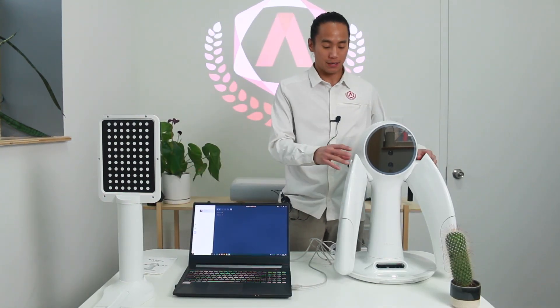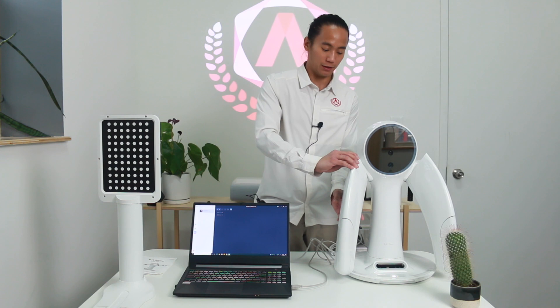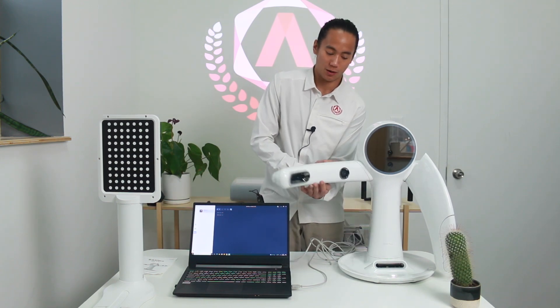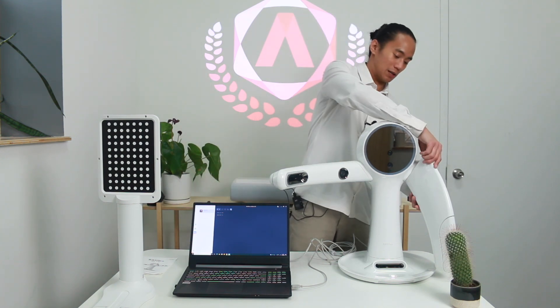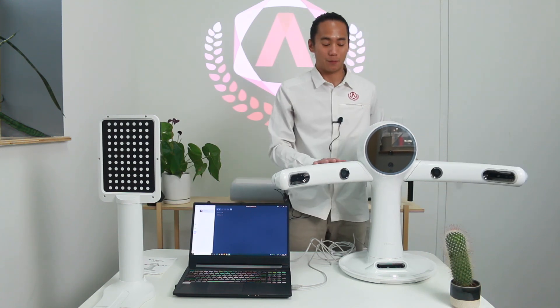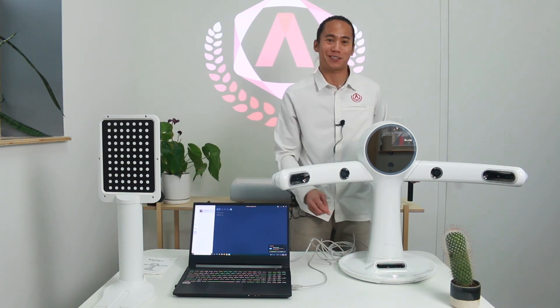Once everything has been plugged in, all you need to do to finish setup is adjust the arms, which are adjusted by two small knobs on the back of each arm. Lift and rotate the arms into place — once they're in position, you'll hear a click meaning they're firmly set. Do the same on the other side, then hold the power button until it powers on.